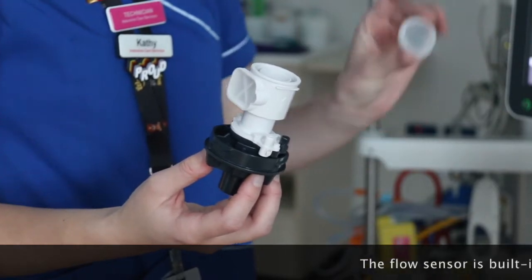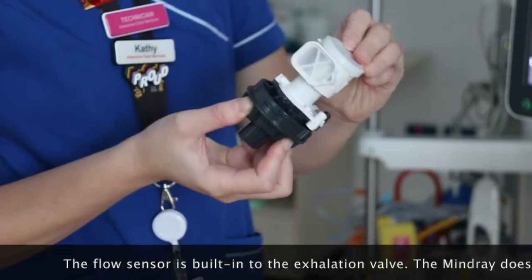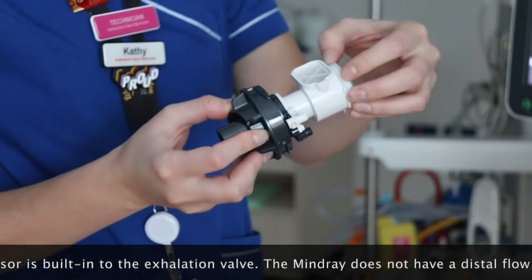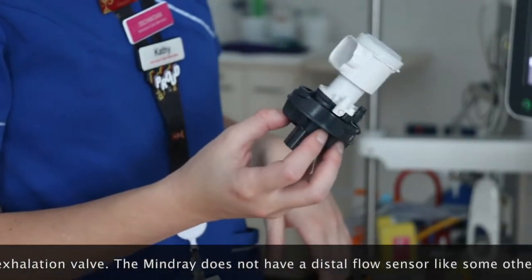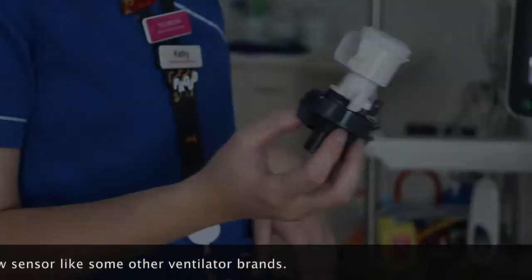This is your exhalation valve. You want the diaphragm to be covering this bit here. We send this for sterilising between every patient, and the most important part of the checks that we've found is calibrating your flow sensor to your ventilator before you do your system check.